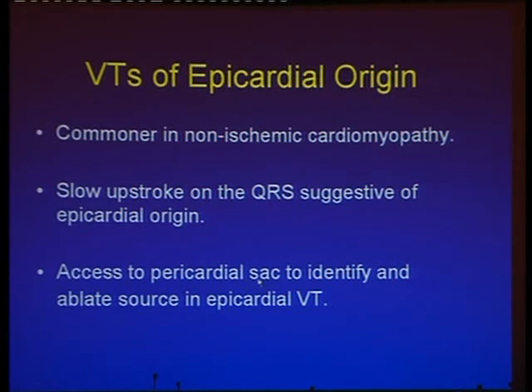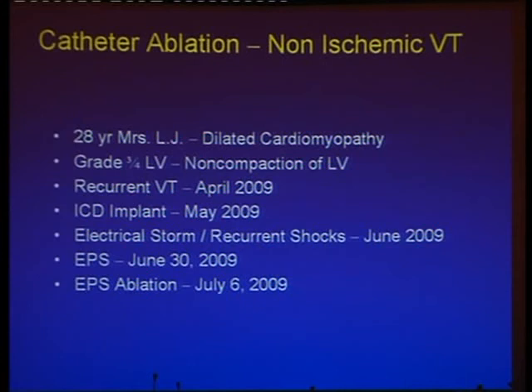I think, again, when you do 2 or 3 cases, everything goes very well. You might tend to be a bit blasé, but I think people who've done a large volume do encounter fairly significant problems. We did have one case where the right ventricle free wall was lacerated, a 1 centimeter tear that had to go to the OR, fixed up. Luckily, it wasn't a big issue, but it just wouldn't stop. I know other colleagues have had laceration of branches of the coronary arteries that then require being addressed. But it's certainly something that increasingly we do.